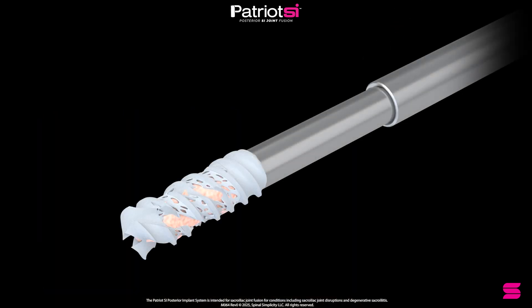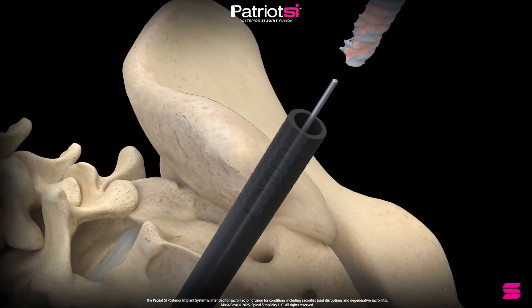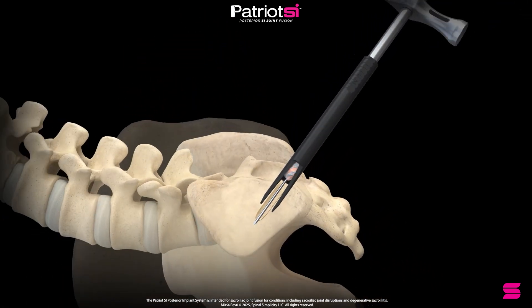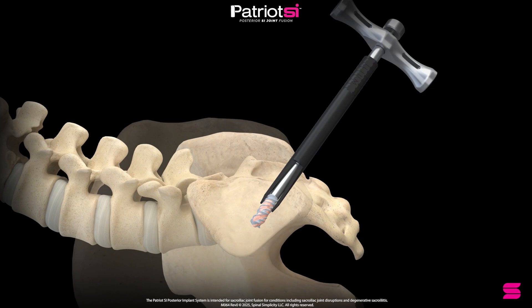Pack the implant with bone graft material. Insert the implant over the guide wire. Rotate the inserter in a clockwise direction to thread the implant into final position. Remove the inserter, guide wire, and joint finder from the incision.